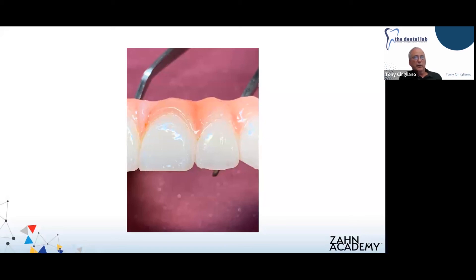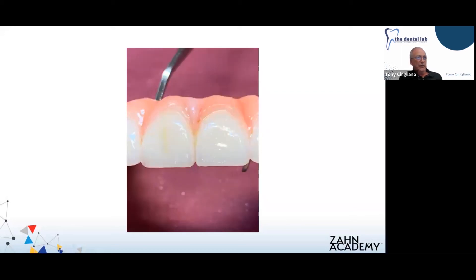You can get as creative as you want, or do as little as you want to characterize it. Be assured that you're going to get a beautiful result just by doing your finishing and glazing. You can see the translucency along the incisal edge and the gradation of color throughout the bridge from the cervical to the incisal. When we first started using the material, we were printing denture teeth — just think of the possibilities of customizing denture teeth with this kit and using Trusana denture teeth, and the beautiful result you'll get.